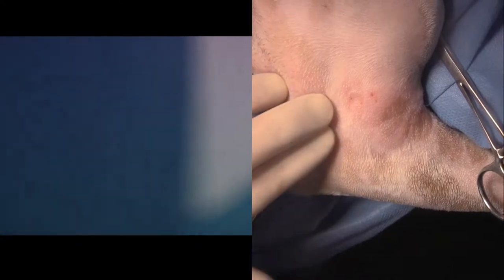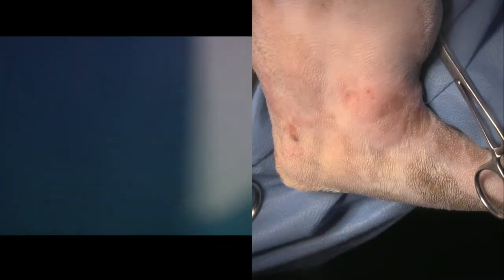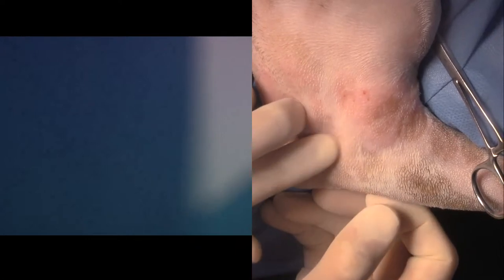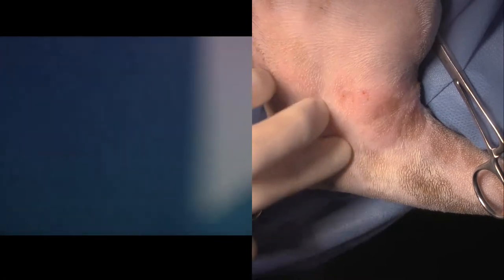And today we are doing an elbow arthroscopy for a fragmented medial coronoid process in about an 8 or 9-year-old regular Kelpie who has a history of really severe left forelimb lameness. We're doing it bilaterally, but I'm only going to live stream one of them. We did a CT scan and found large fragments on both sides.